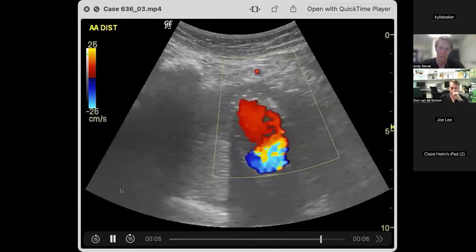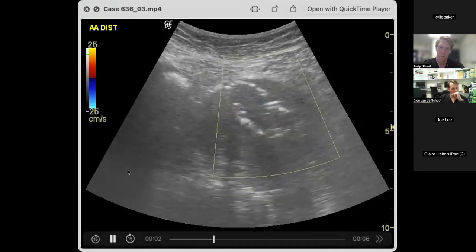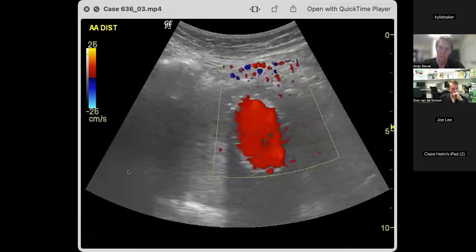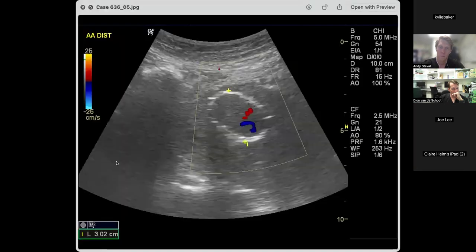So certainly you're looking at that, I'd say, yeah, maybe, but I'm not particularly fussed by that loop there, because I often see things that look like that. Let's see if we can go a little further on through this to some of the other stuff.